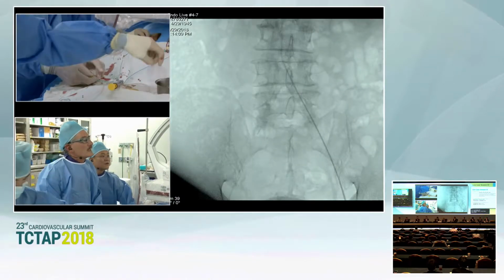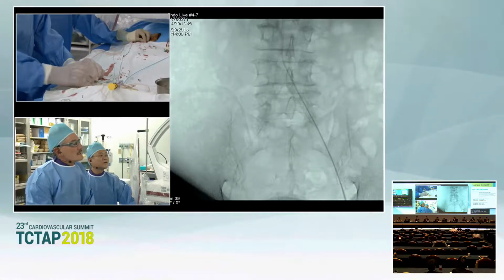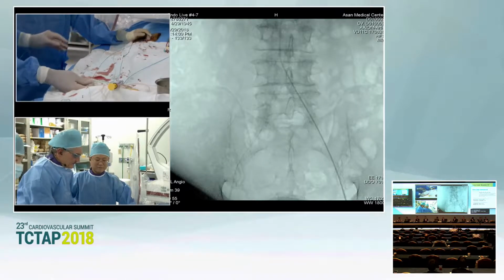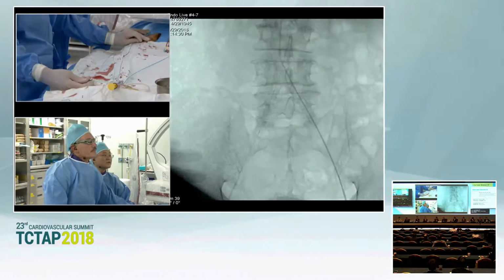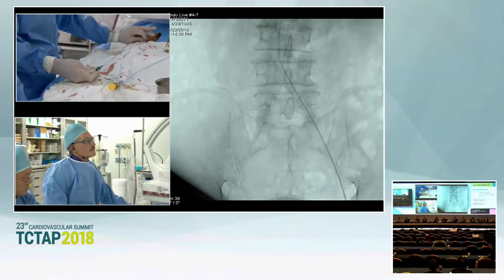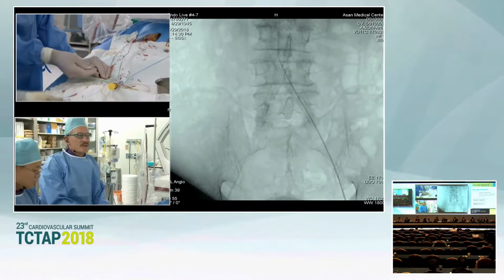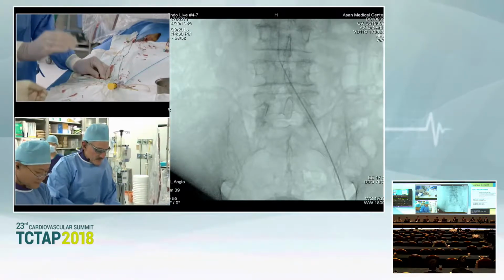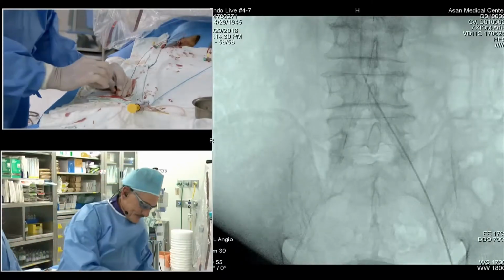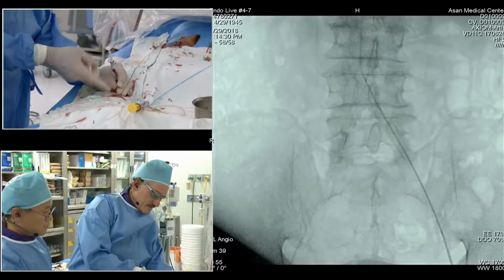I think maybe I just got it. Wow. Yeah, I think we're through. Excellent job. Well, I can tell you from the tactile feel, this was heavily, heavily calcified. This was a 30-gram Astato wire, and it was giving a lot of resistance. But I believe we're through. We have nice blood return.